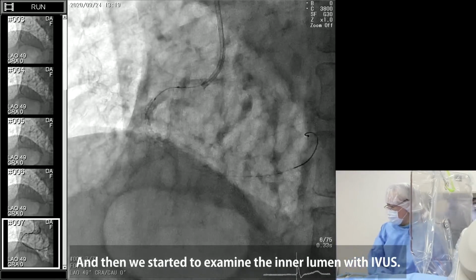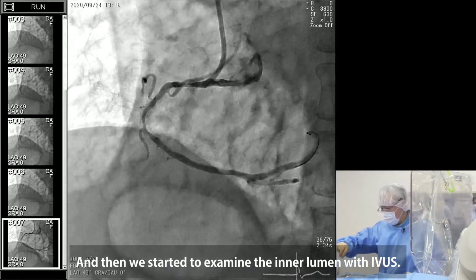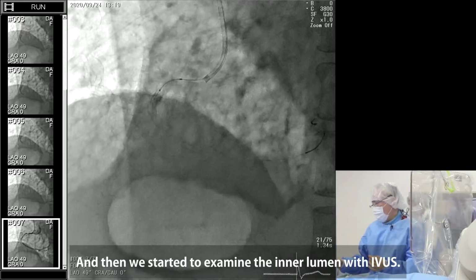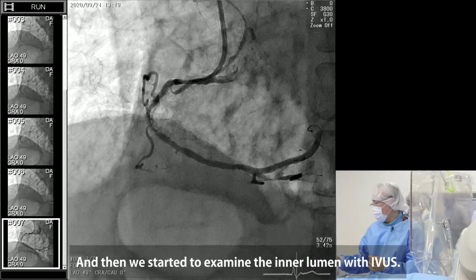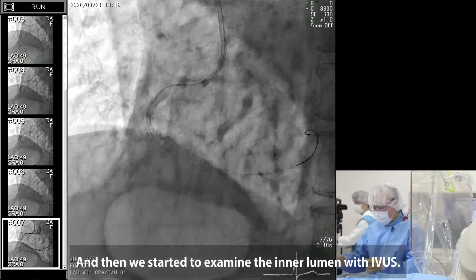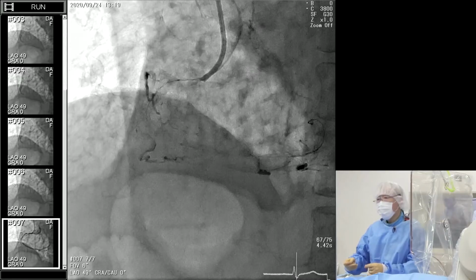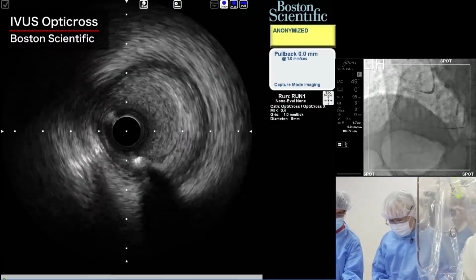And then we started to examine the inner lumen with IVUS. IVUS start.